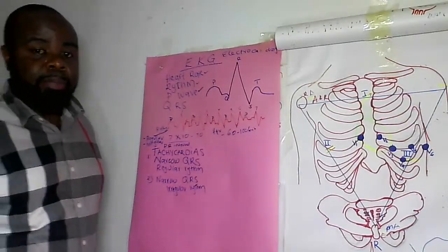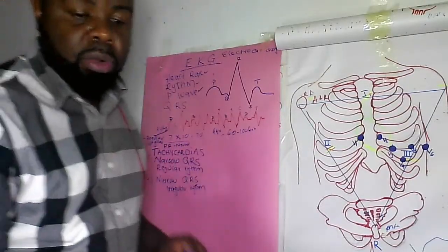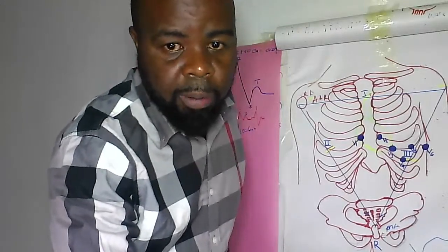These are two that are common with irregular rhythm.